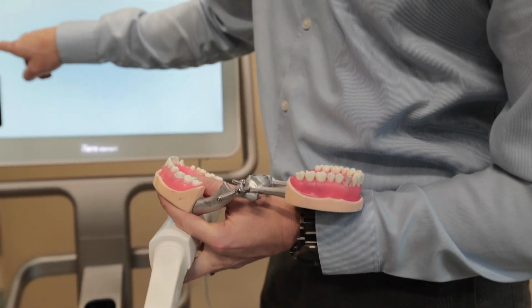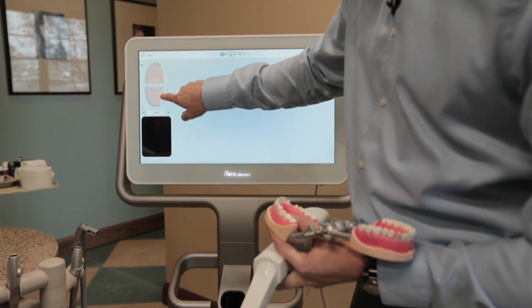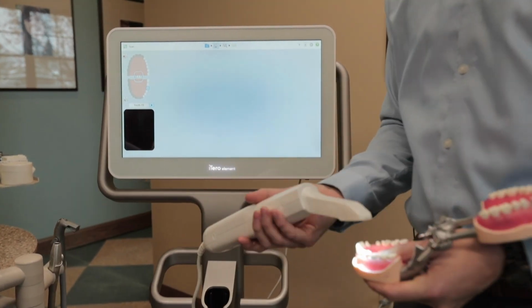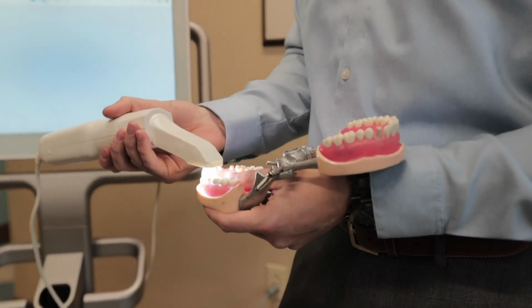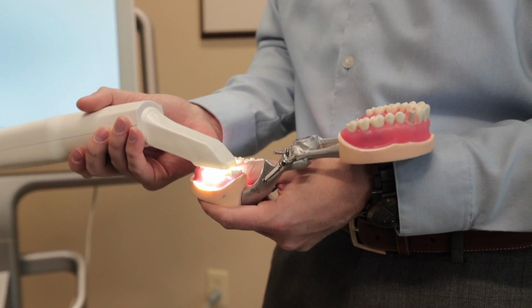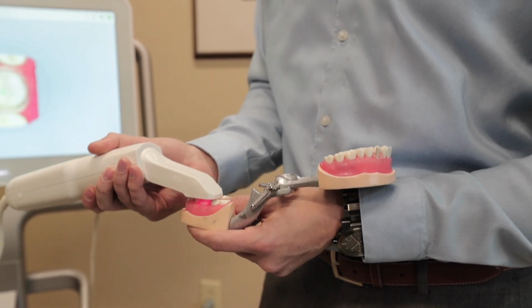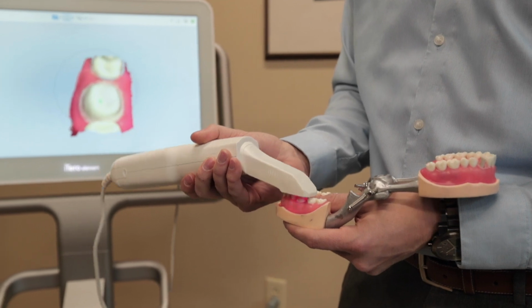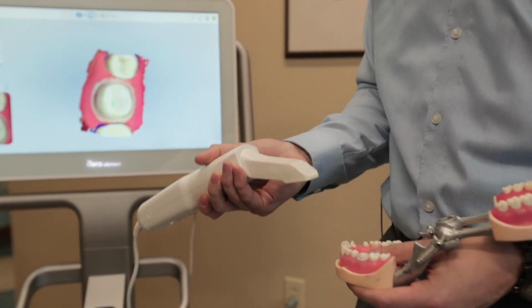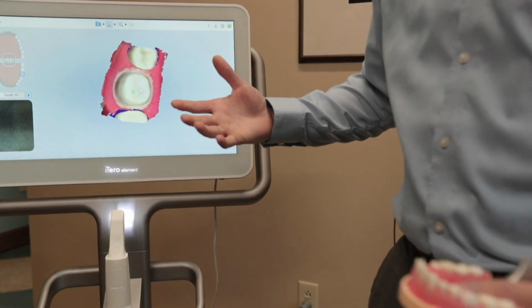You can see right now we just have the prep highlighted. We also have the arch, okay? So we start with the prep, and the reason we do this is we wanna put the scanner right over the tooth that we're prepping. And we wanna capture this in 5 or 10 seconds. So I turn it on, and I'm just gonna rotate a little bit to the lingual to the buccal. I'm just gonna get all of my contact points and make sure I get that margin line, okay? Just gonna put this back and look. So that was about 5 or 10 seconds.